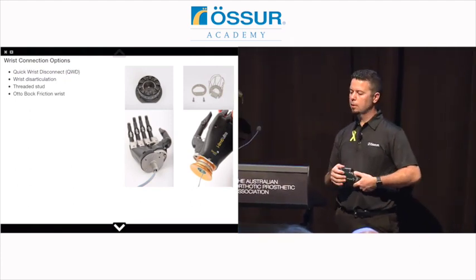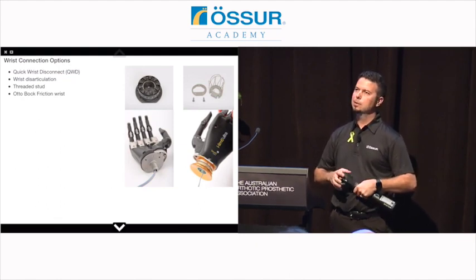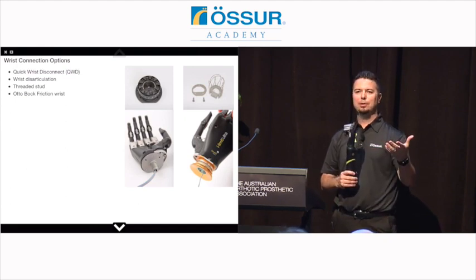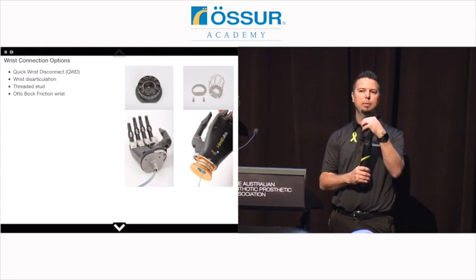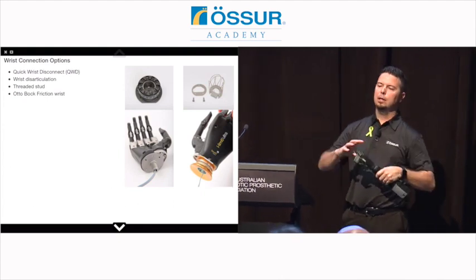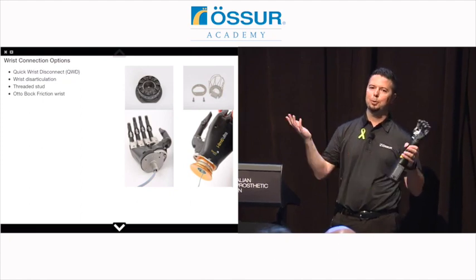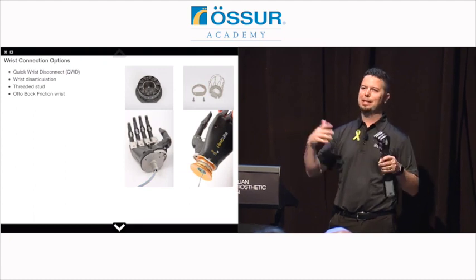Two other options are the threaded stud. That was my nickname in high school. Just kidding, it wasn't. The threaded stud is just your endoskeletal style connection to decrease weight. It still allows you to pronate and supinate. However, you cannot quickly disconnect the hand. So that's something to consider. But I'm talking to a room that knows prosthetics is all give and take, right? You've got to give something up to get something.